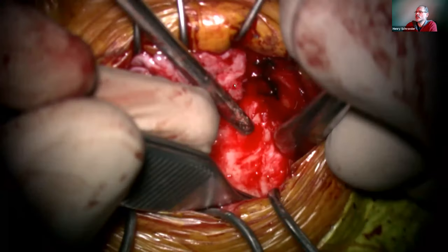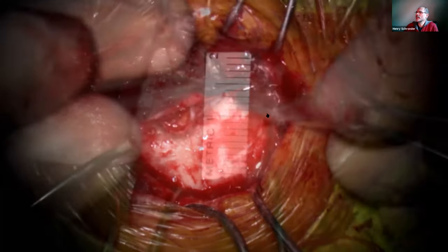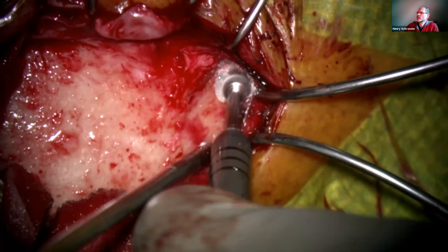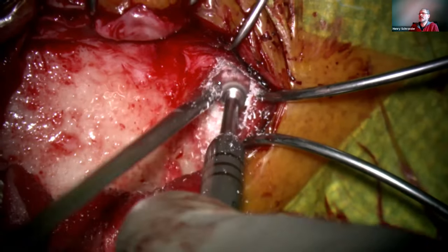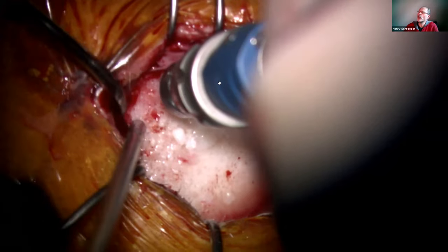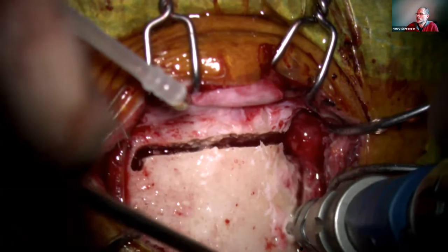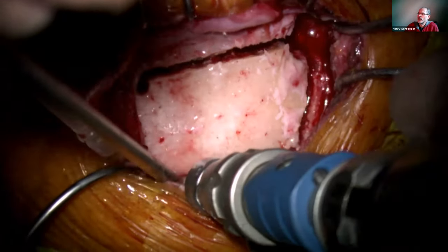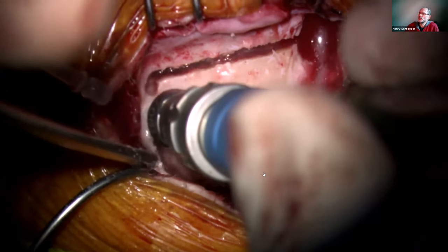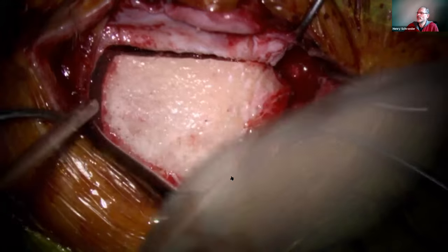It's very important that your craniotomy is really flush with the skull base. Then we detach the temporal muscle from the superior temporal line, and it should be about 2 by 2 centimeters, then it's okay. So we place a small burr hole behind the superior temporal line. You have to be careful that you do not go too deep, otherwise you end up in the orbit. Then the first cut is at the base, and then the second cut goes up so that you get your height. If you make the craniotomy too flat, it's not good because you have difficulties to see the skull base, especially in the initial part of the surgery.